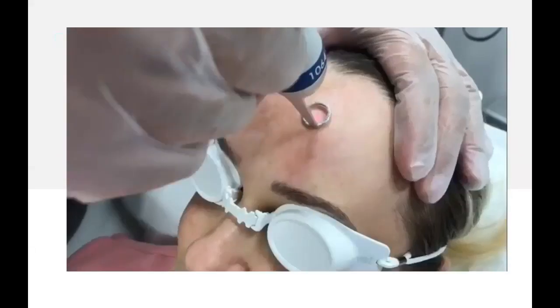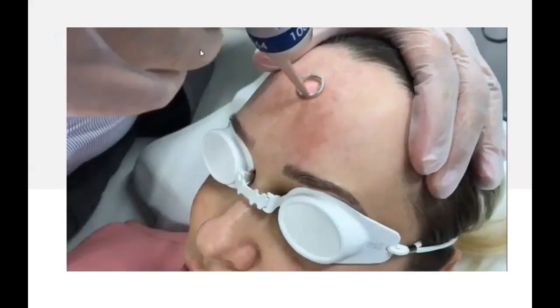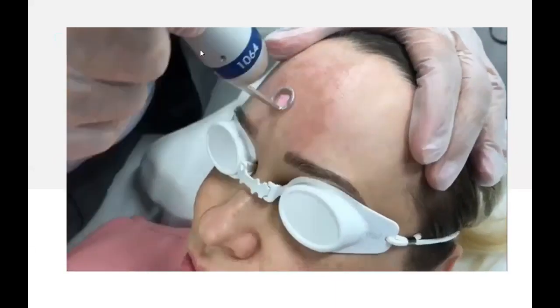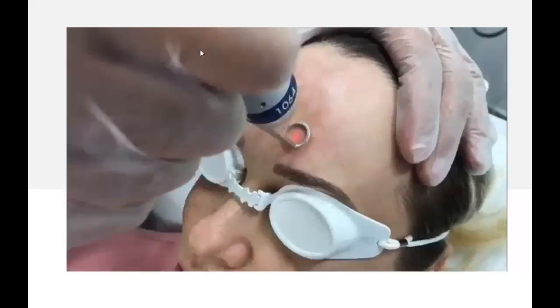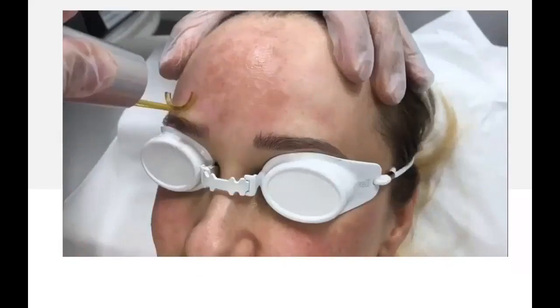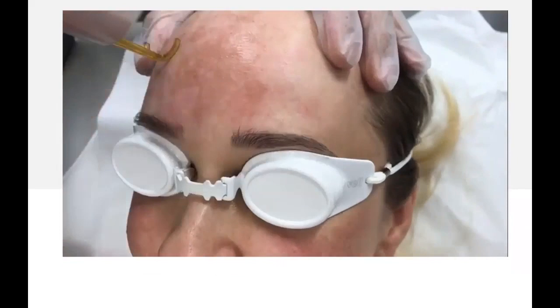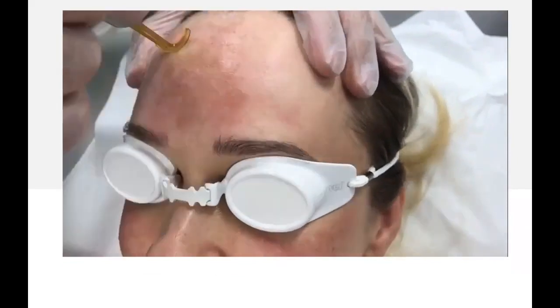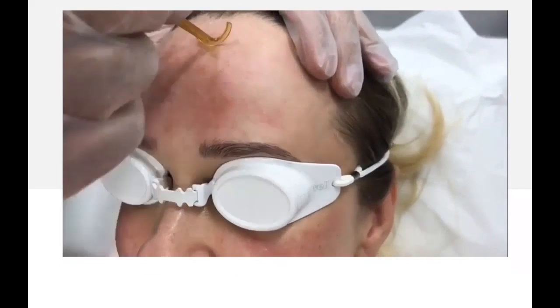This is just a short video to demonstrate how this works with the 1064 Resolve handpiece. So that would be the first. And then this would be followed by the large spot Zoom, 1064. So that's a large spot, low fluence, 2 to maximum 4 passes with erythema as a clinical endpoint.